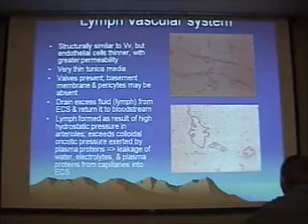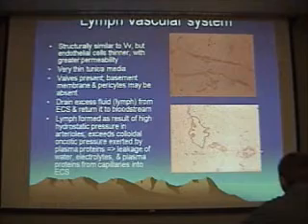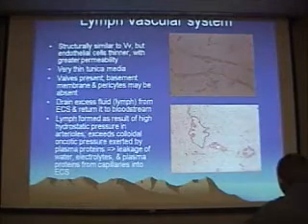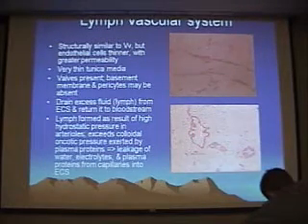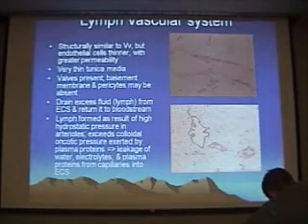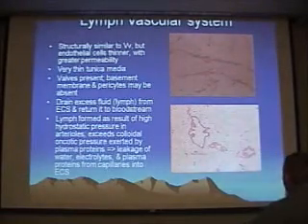When you look at lymphatics in cross-section, they look like nothing. Here we have two lymph vessels which are constricted and barely recognizable as vessels. Here's one that's dilated because it actually has lymph flowing through it, and even so there's virtually nothing in the wall — it has virtually no structure or architecture. So that's another clue for identifying lymphatics as non-blood vessels.